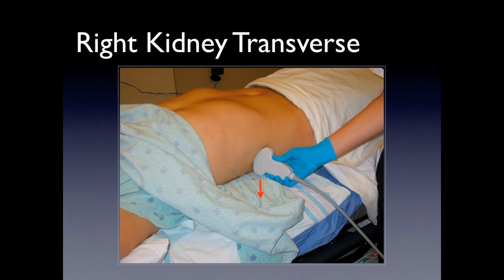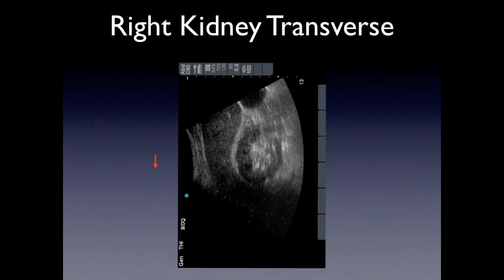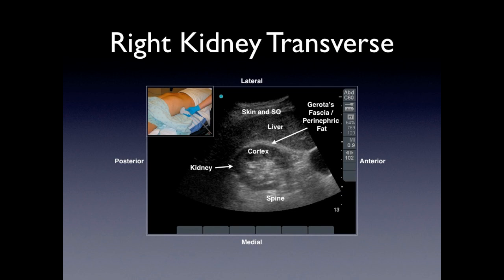For the transverse view, you're going to rotate your probe counter-clockwise about 90 degrees, with the indicator towards the bed. You're going to be seeing an image with your probe on the lateral side, the medial side, the anterior and the posterior, and your indicator pointing down. You have some skin and subcutaneous tissue, the liver, Gerota's fascia with perinephric fat, and the kidney.